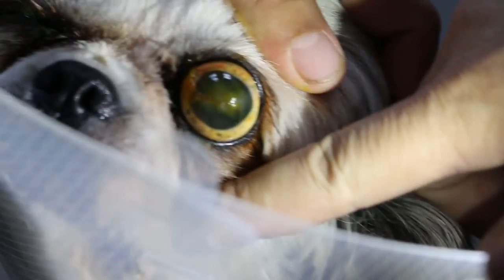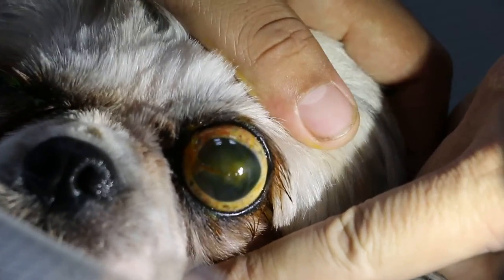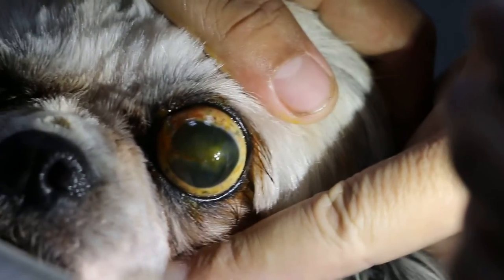It's very clear and quite a deep one. This is the central ulcer. This one has been a long time. So this is the brown color — the scar is the brown color. You can see the brown color with the fluorescent stain.